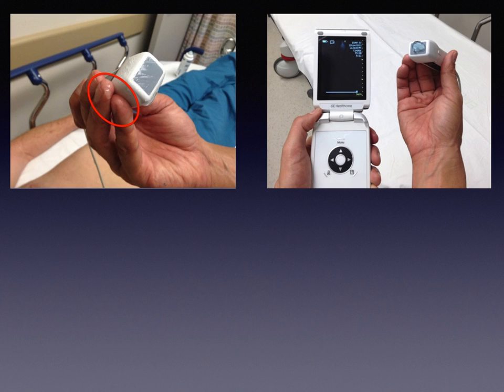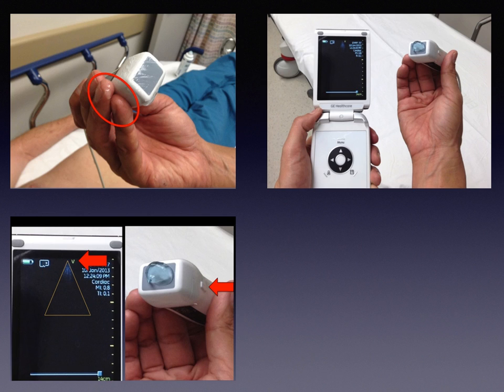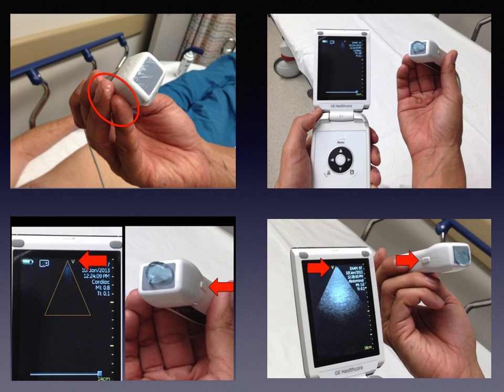We approach all patients from the right side, just like the physical, and hold the probe with the right hand, which could be gloved, and hold the device with the left hand, as shown. In regards to whether a device is oriented according to a radiologic or cardiac standard, we simply look down the barrel of the probe and align the directional marker on the probe with the screen marker. Sometimes you have to flip the probe 180 degrees to make it match. Using this method, one can use any machine or any device without knowing how to delve deep into the programming of the machine.